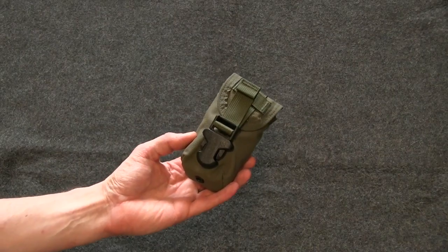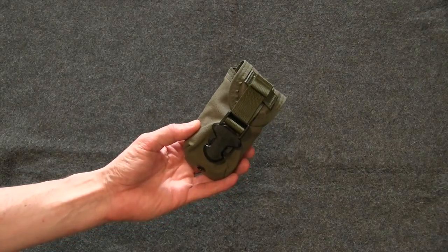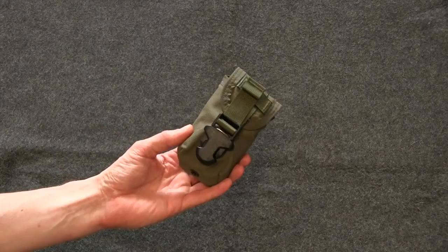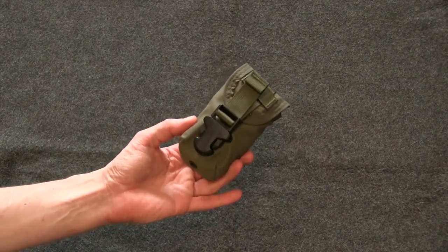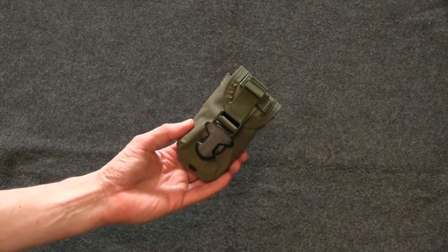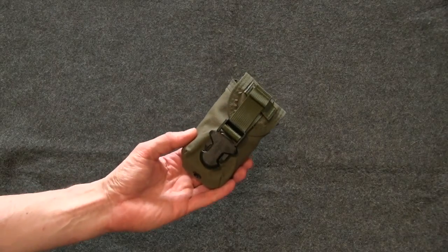Hello, this is a short video about my tourniquet, and you might be wondering why would anyone want to have a tourniquet around. Let's say if you work with heavy machinery or you are into firearms, accidents do happen and it's good to be prepared. Tourniquets will save your life if you are having massive bleeding, in most of the cases anyhow.